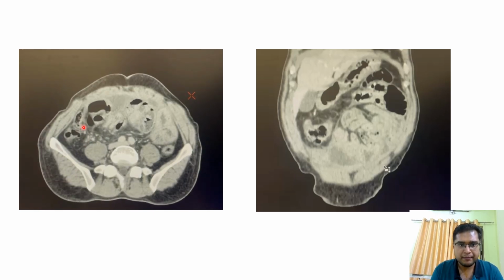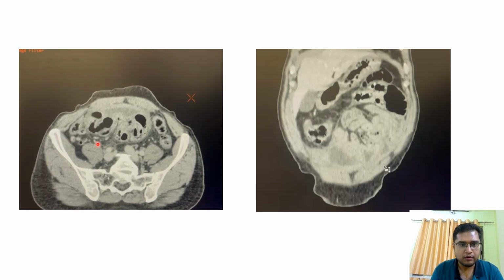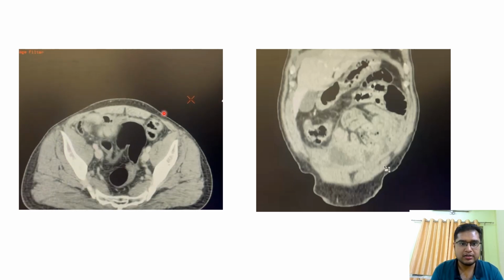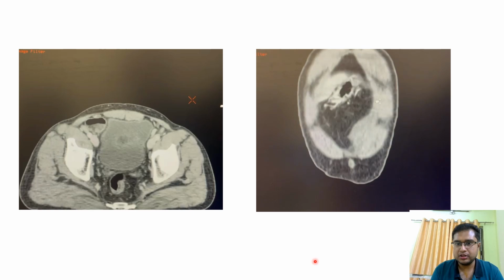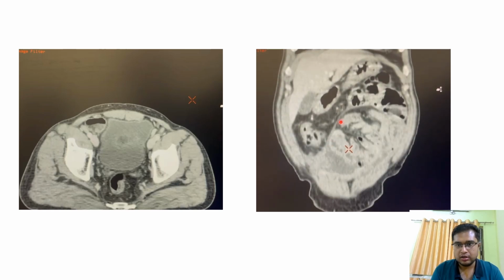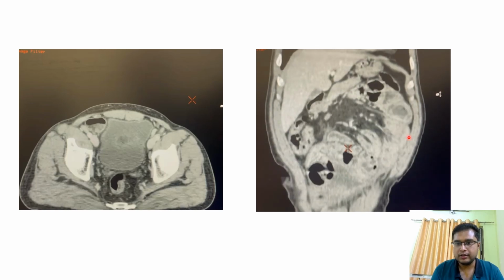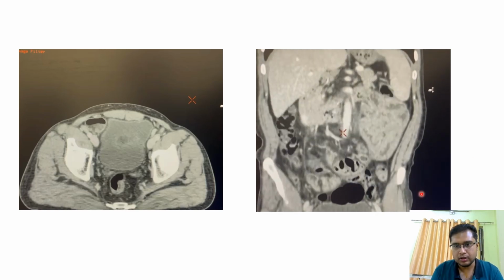we can see that thin peritoneal fold that is actually covering. You can see this covering the bowel loops, thin peritoneal membrane covering the bowel loops, and they are clustered in the midline in the abdomen. This is the coronal section of the same patient, where again you can appreciate that thin peritoneal covering and the cluster of the bowel loops along with the fluid, the dilated bowel loops along with the fluid, and some mesenteric lymph nodes.